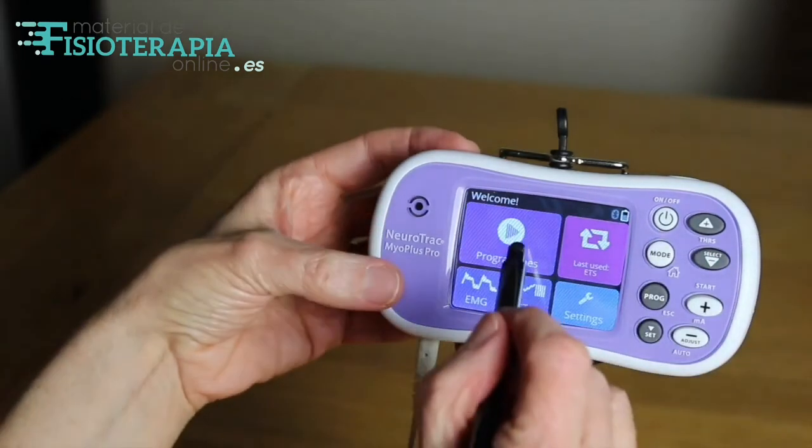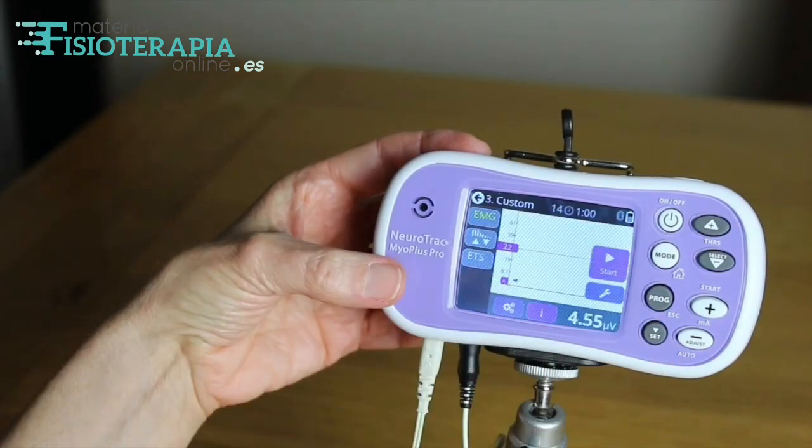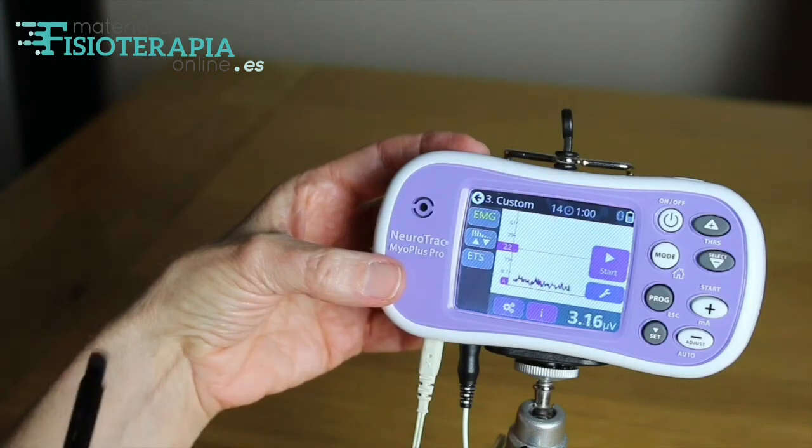You may want to add ETS to one of your customised programs, as set up here in customised program number three. To summarize, the MyoPlus Pro is a versatile unit with many different functions.